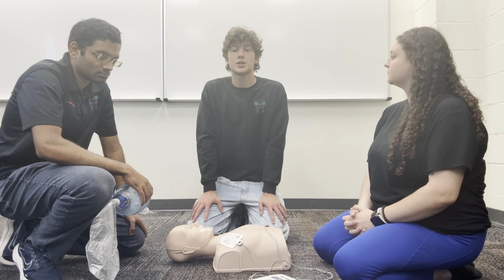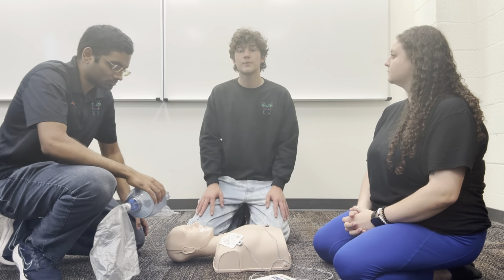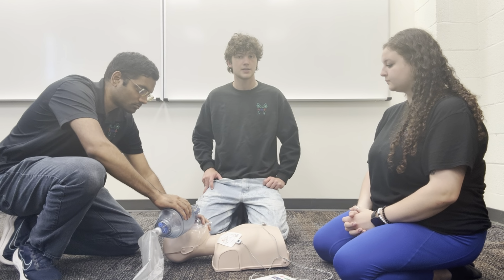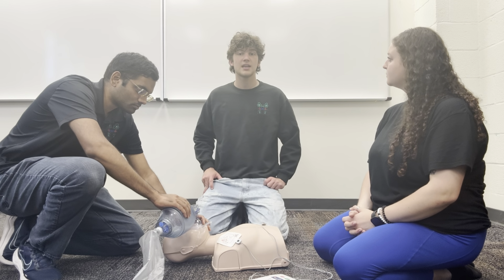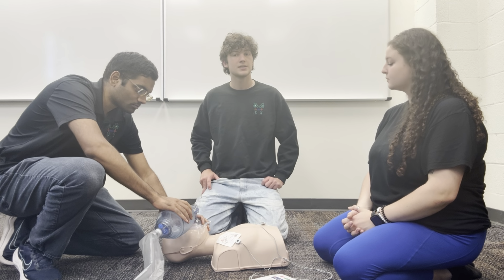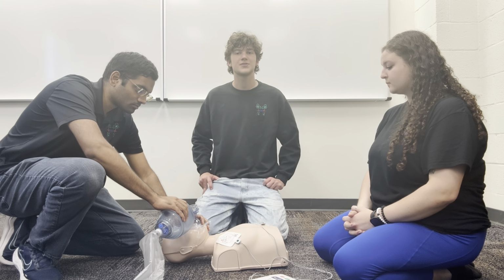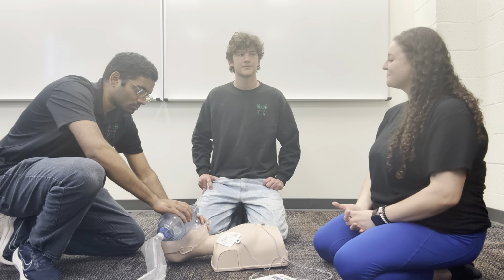If the patient has returned to pulse but is still not breathing, continue with rescue breathing, which occurs using the CE clamp and chest rise ventilation standards. Breaths should be given every 5 to 6 seconds in adult scenarios and every 2 to 3 seconds in pediatric scenarios. Congrats, you successfully ran your first code.